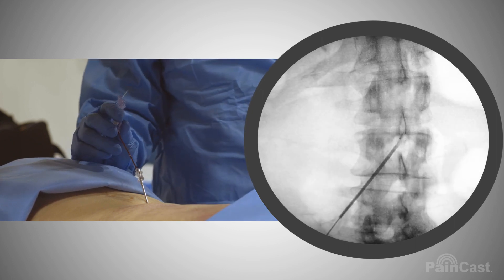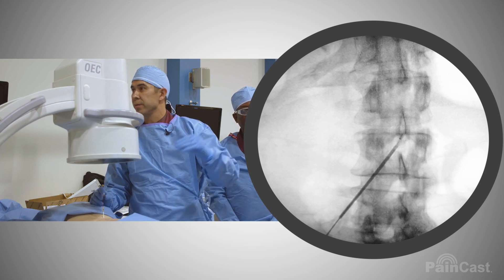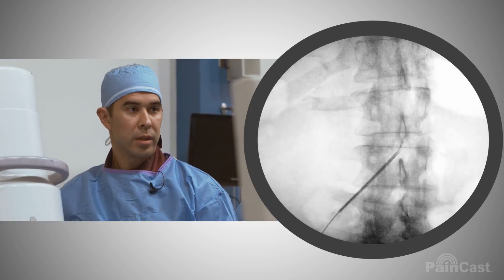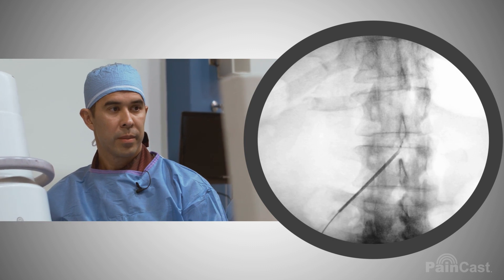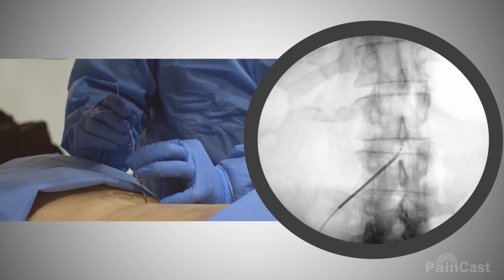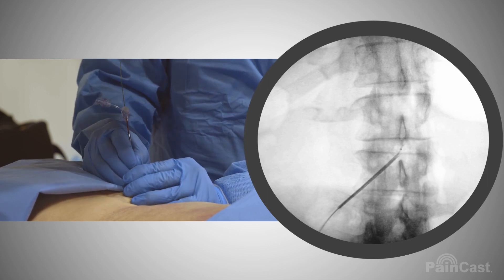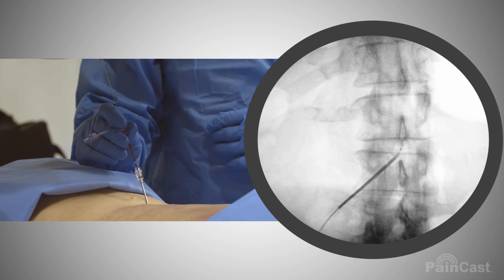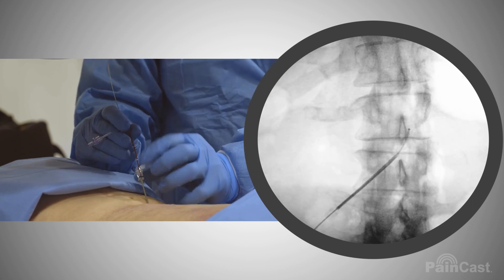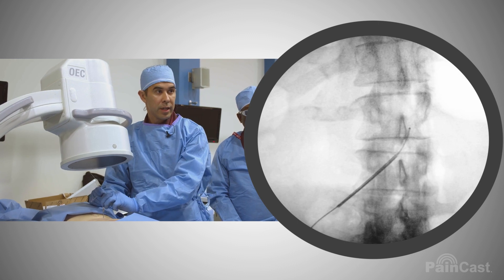At this point, because I know I'm in the middle, can we angle to the feet to just line up the bottom end plate of L1? Perfect. So I'm going to angle my bevel towards that foramen, and I'm going to turn that introducer to exit.